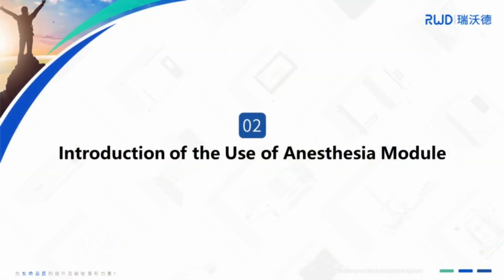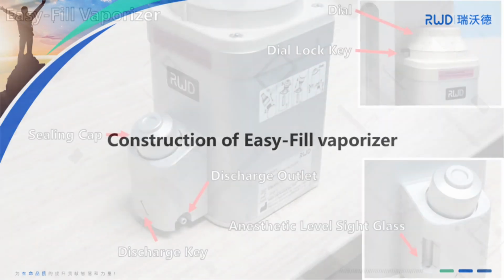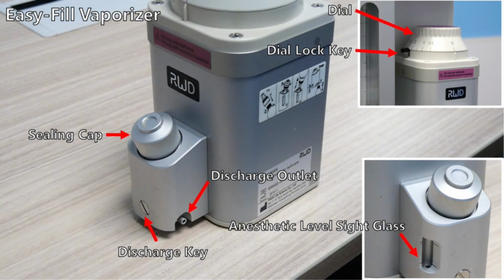Introduction of the use of anesthesia module. Attention please, the vaporizer must be filled with appropriate anesthetic, otherwise it may cause damage and clinical risks. The structure of easy fill vaporizer is as shown in the video.